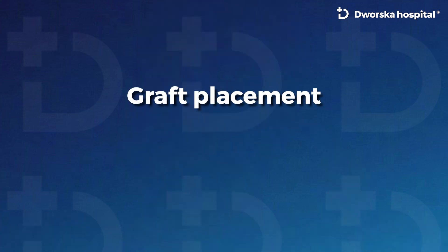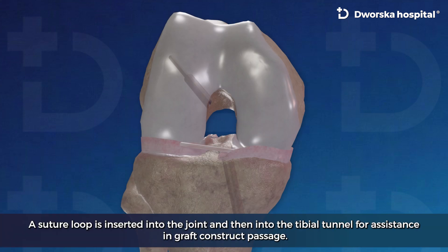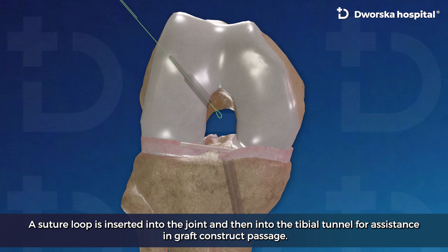Graft placement. A suture loop is inserted into the joint and then into the tibial tunnel for assistance in graft construct passage.